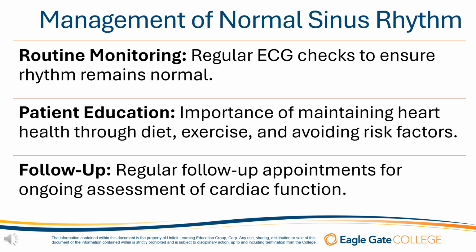This is not generally done on a typical healthy patient just walking around, but if they're in for surgery, post-surgical, or in the ICU for any other reason, we're going to want to make sure that this rhythm remains normal. Utilize wearable monitoring devices if needed.